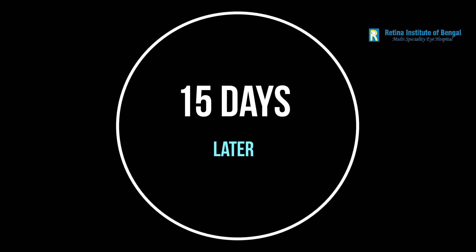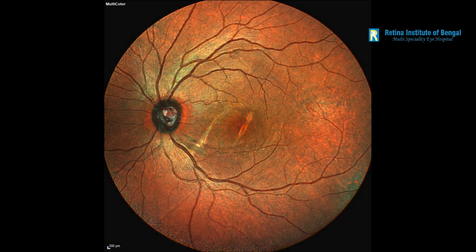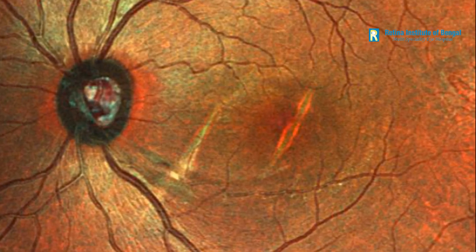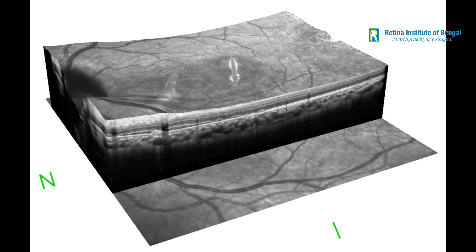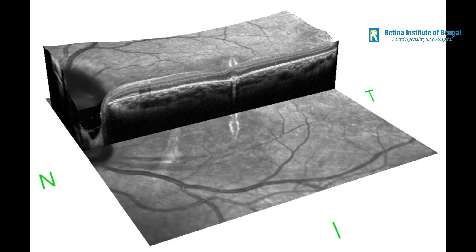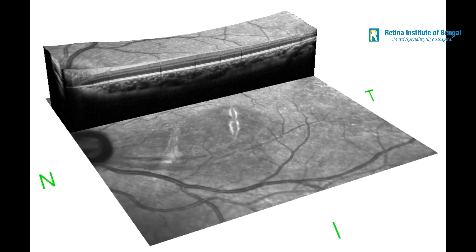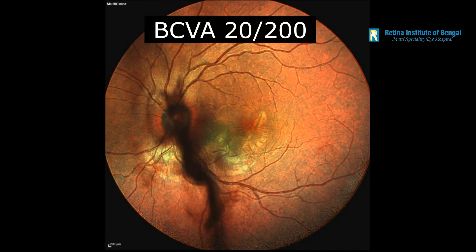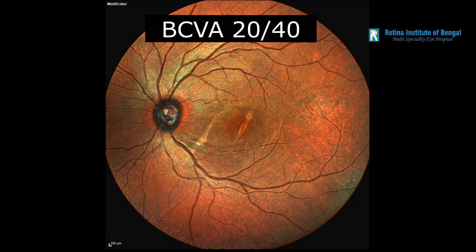15 days later, the patient came back. He was very happy. He said he had significant improvement in vision and the retina was absolutely stable. The sub-retinal blood had been displaced beautifully. The OCT also showed that the fovea had been attached with significant resolution of the sub-retinal fluid. This was an interesting case of blunt trauma leading to sub-retinal bleed, which was very well managed with vitrectomy and sub-retinal TPA injection, and vision could be successfully restored.